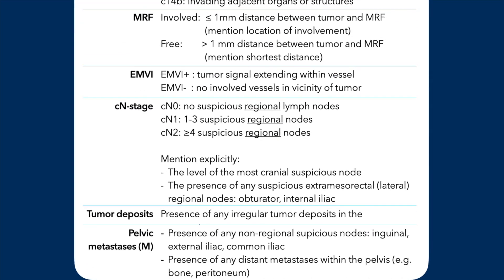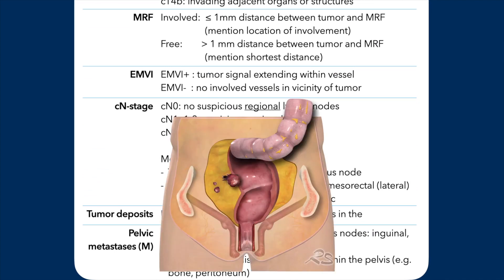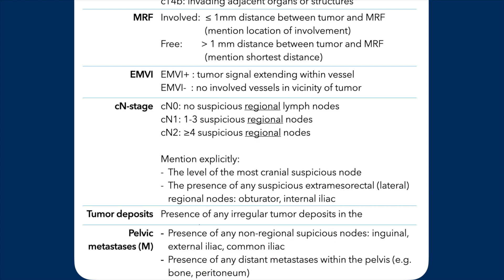Then we have the mesorectal fascia, which is very important because in standard rectal cancer surgery, the surgeon performs the total mesorectal excision (TME) along the mesorectal fascia. So when the mesorectal fascia is involved, you cannot operate and need to do neoadjuvant therapy. Then we're going to talk about EMVI — extramural vessel invasion — and the lymph node stage.